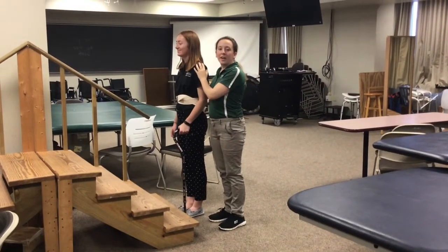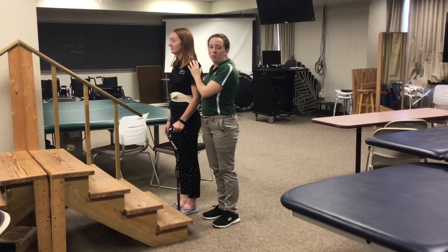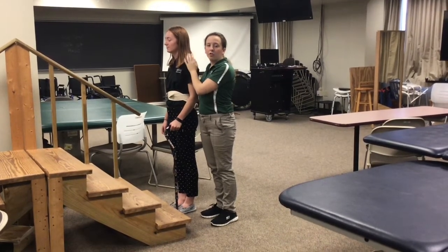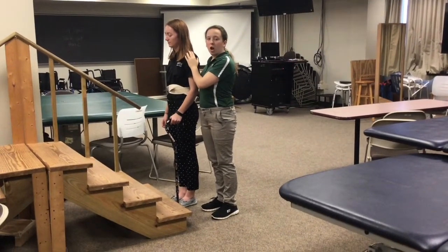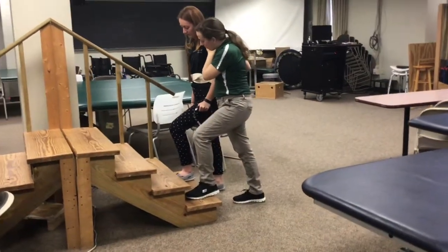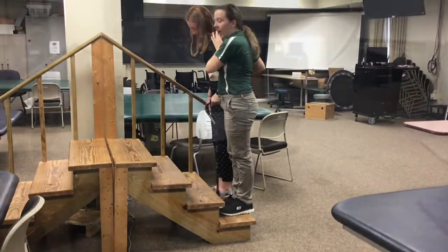Now we will cover how to ascend a curb. This is similar to ascending stairs, but there is only one step and no handrail. You will begin by standing in stride with your patient with a hand on their shoulder and a supinated grip on their gait belt. So first your patient will place their uninvolved extremity onto the stair. Can you move up your uninvolved leg and then shift weight onto that, extend that knee, bring up the involved leg and then the cane.